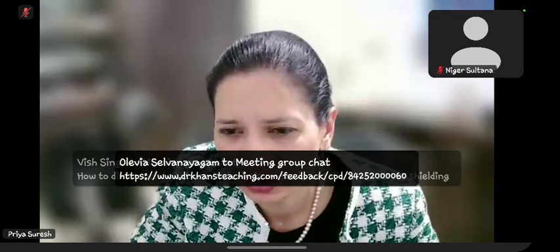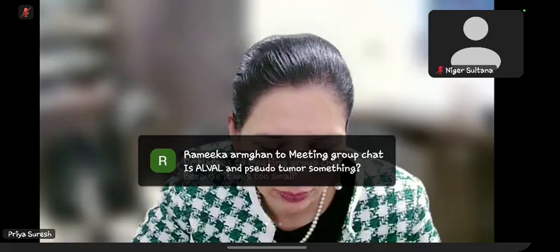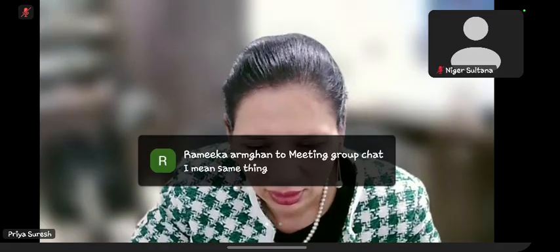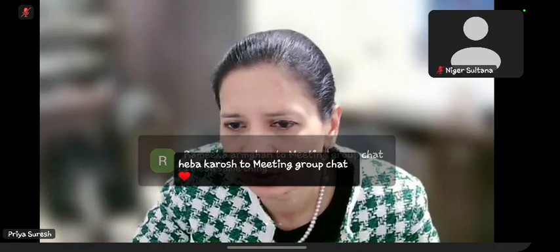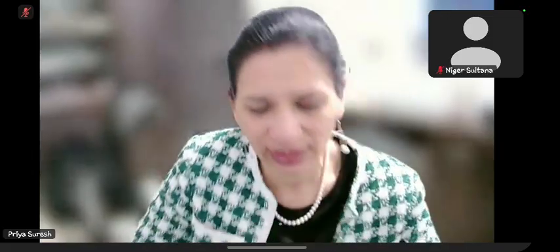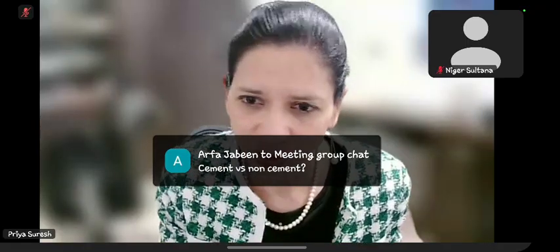Okay, so do you biopsy these cases? No, I mean, because like I said, if it is around the prosthesis and you have evidence of previous imaging showing that there is osteolysis, then we discuss with the hip surgeons, the arthroplasty surgeons specifically, and they take them to theater. So we don't do that. Is osteolysis similar to particle disease? Yes, like I said, you can have either osteolysis, like bony changes, or you can have it in the soft tissue like pseudotumors.